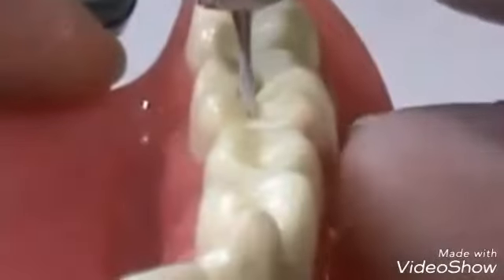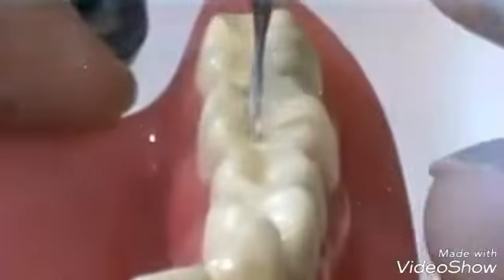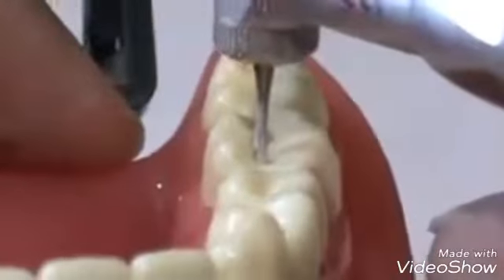Here, the bur is perpendicular. The walls, the buccal and lingual walls, are perpendicular to the occlusal plane. They should be converged occlusally about 5 degrees.